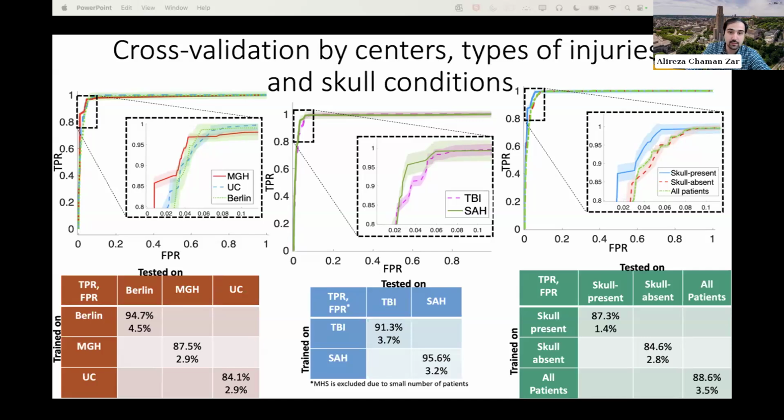Patients without skull, like I said, add some challenges to the detection, such as breach rhythm. Because of the imperfection in the skull, absence of a skull would mess up some lower frequency components that we are actually relying on for non-invasive detection. The other answer is the accumulation of air pockets underneath the parts that we are detecting in the scalp. That will also reduce the conductivity and make it more challenging. That's one possible explanation why we get better results for skull present versus skull absent.